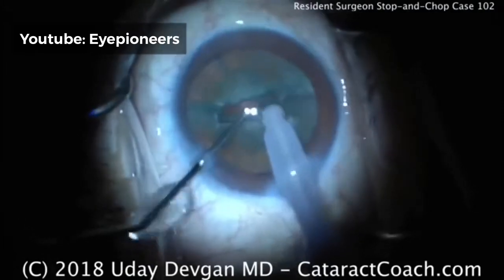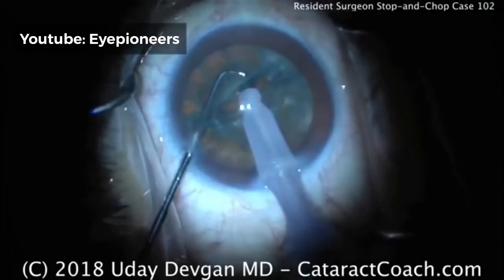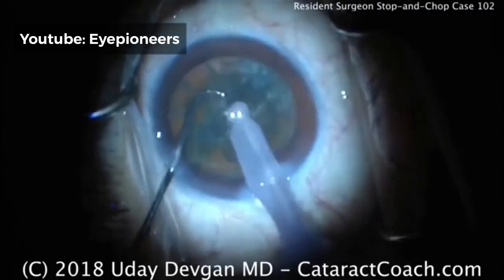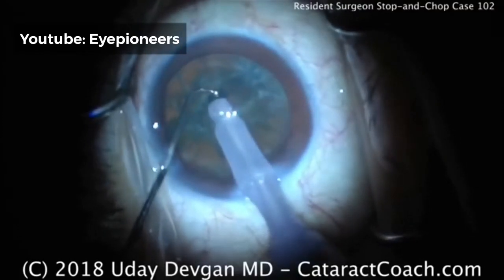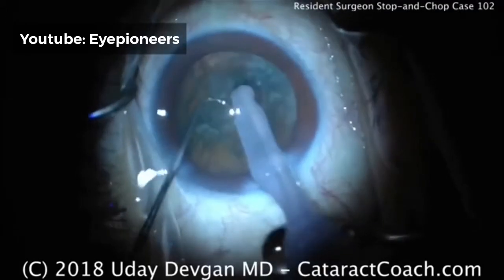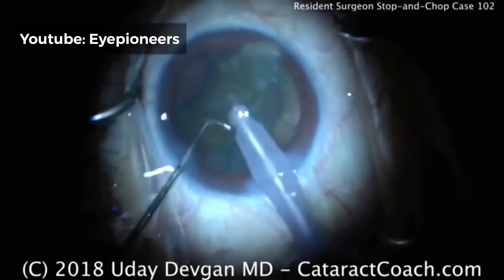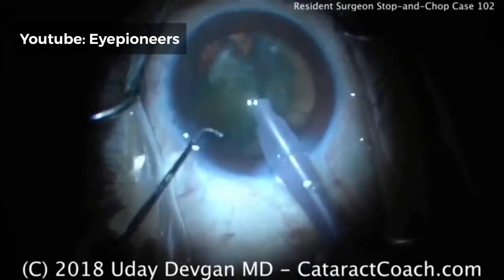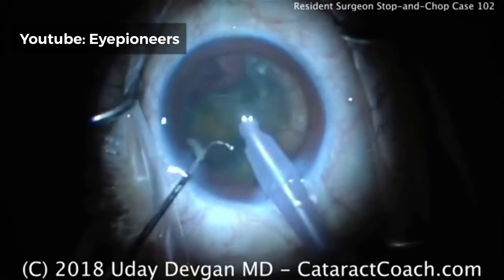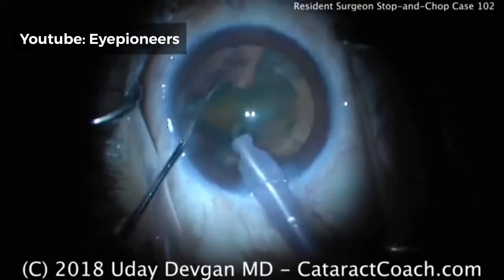Now we go to high vacuum, high flow mode to bring the piece up. Buzzing into the nucleus in the center is tough to bring the piece up, so I'd encourage you to buzz in towards the end or the edge — the corner. It's easier to bring one corner of this half up out of the capsular bag; if you try to hold the middle of it, it's too big and bulky. Buzz in the probe at the corner of one of these halves, then the half can come up. Chopper goes around it and breaks off a piece — beautiful chop. Notice the eye is staying in primary position; this is half the battle when you're just starting to learn.